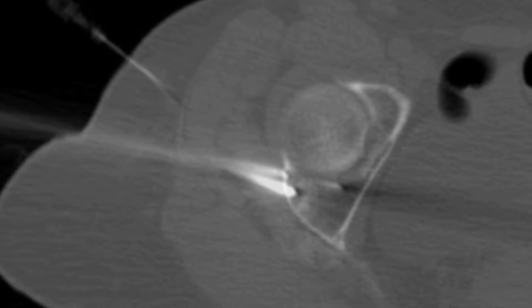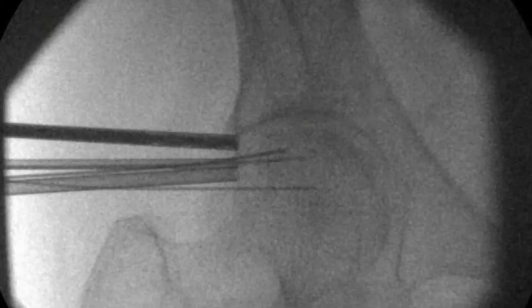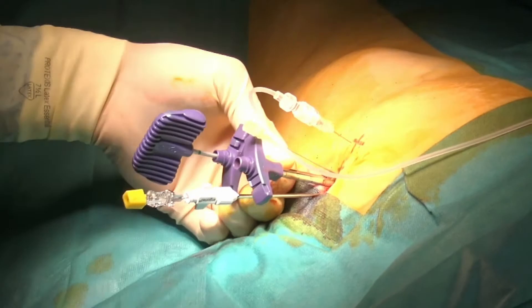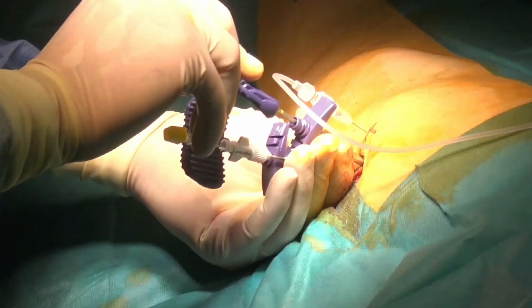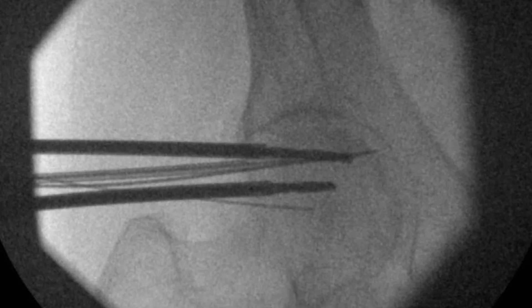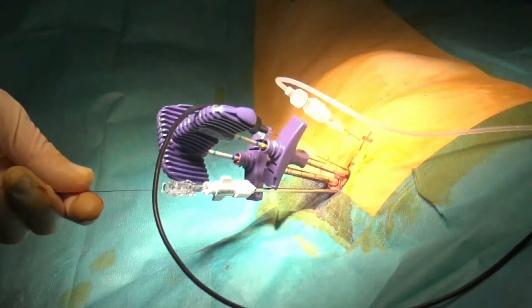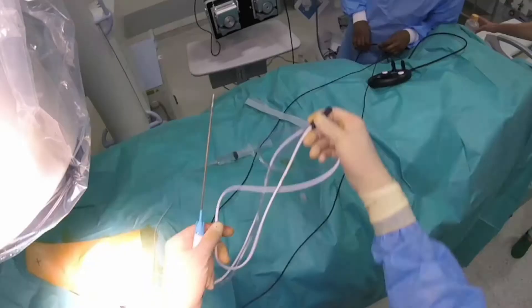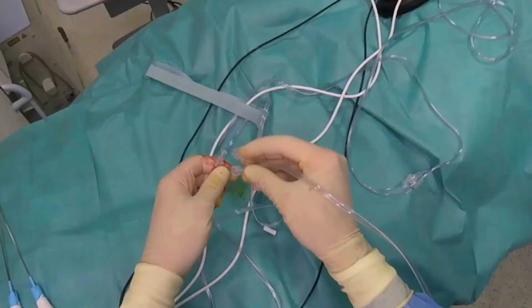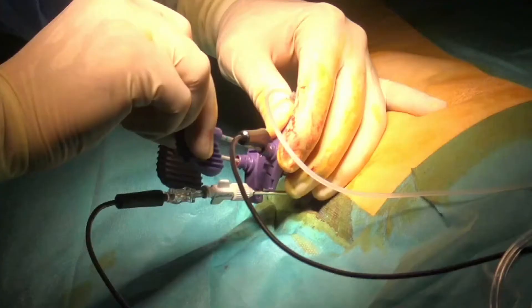Now that all needles are in position, it's time to introduce the radiofrequency ablation probes. First, the stilets of the introducers are removed. The Osteocool drill is used to create a pathway within the cancellous bone and to choose the proper active tip length. Drilling is first performed on the superior introducer and then on the inferior one. In that case, two 20 mm active tip probes can be inserted. A dedicated Osteocool-compatible 28-gauge thermosensor is inserted inside the 20-gauge needle.